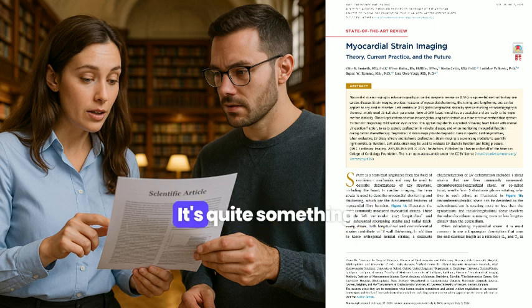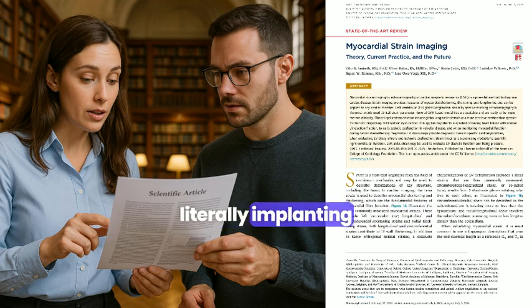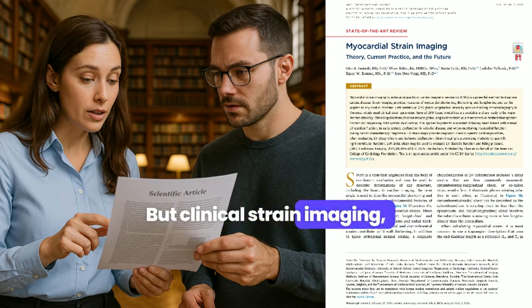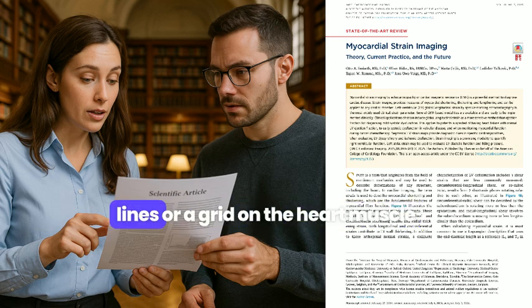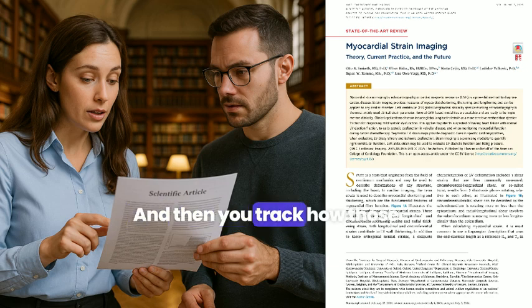Got it. It's quite something how far this has come. The history section was interesting. Oh, definitely. I mean, the initial ideas involved literally implanting tiny ultrasound crystals. Wow, invasive. Very. We're tracking little radiopaque markers with X-rays. But clinical strain imaging, the stuff we use, really took off with CMR, cardiac MR. When was this? Late 80s. They introduced tissue tagging. Think of it like drawing temporary lines or a grid on the heart muscle using radiofrequency pulses. Okay. And then you track how those lines deform as the heart beats.